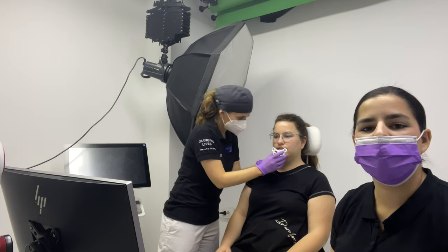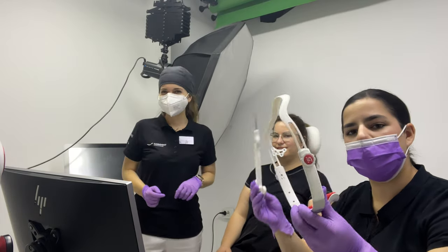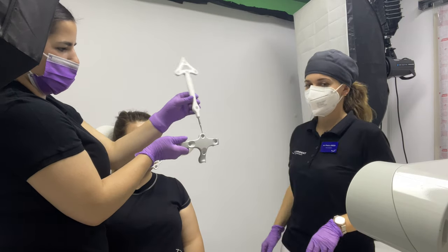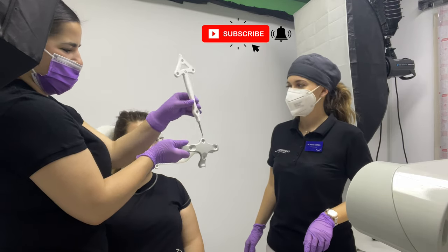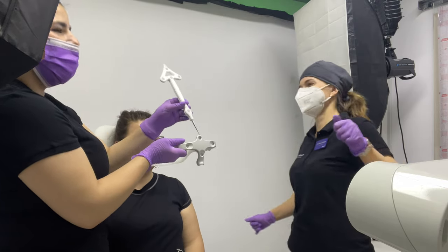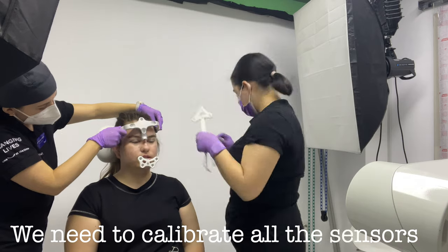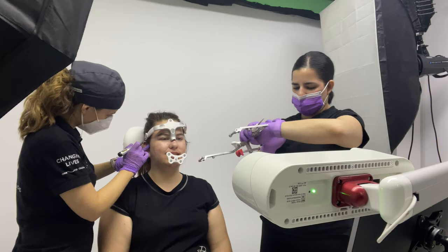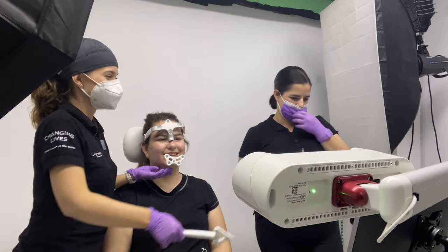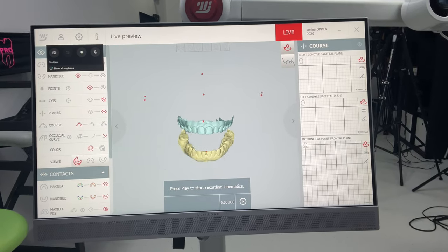Placing the inferior butterfly onto the sensors that we fixed in the mouth. And now we have to also mount these two parts. And go. Okay. Yes. Great. Okay. Close and magic. Yes, Corina makes some moves. And she's doing the same thing in real life. Put your tongue back inside.